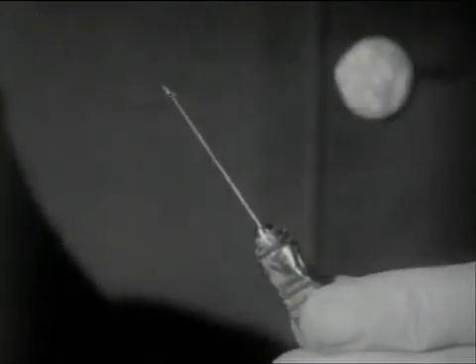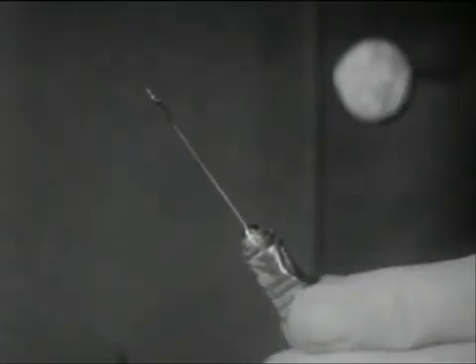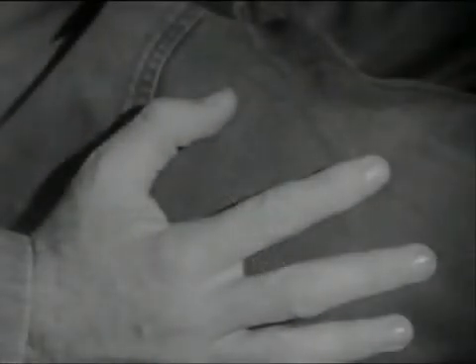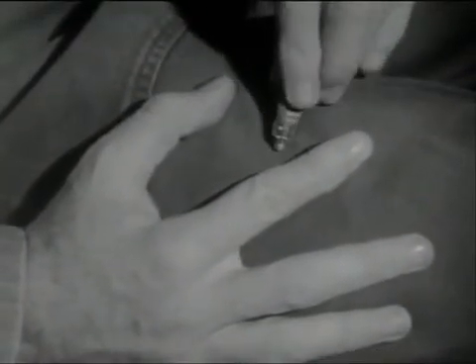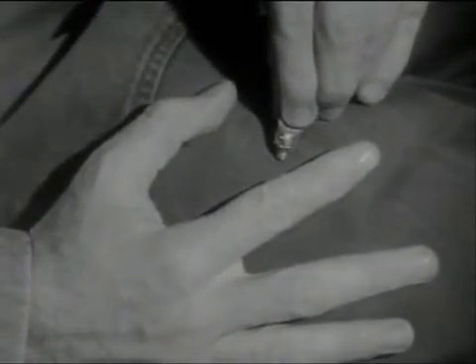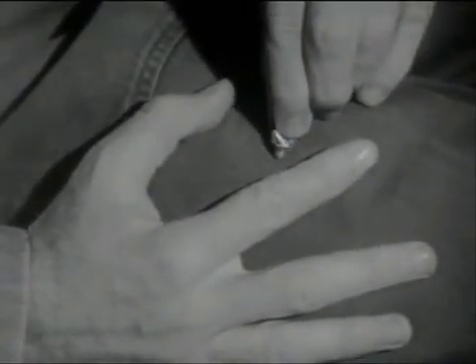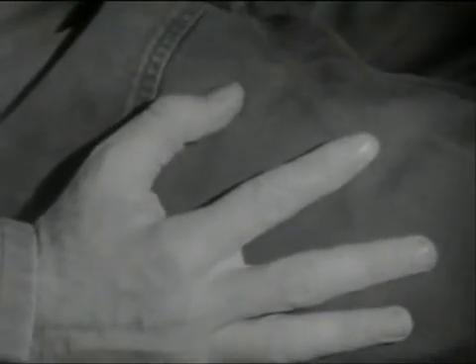The wire loop is removed and discarded. The needle is injected into the muscle. The injector is grasped at the point where the needle joins the tube. The tube itself must not be squeezed until the needle has been completely inserted. Then the tube is squeezed slowly until the entire contents have been injected.